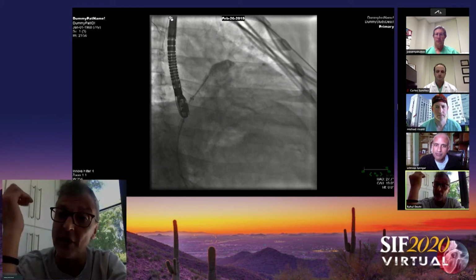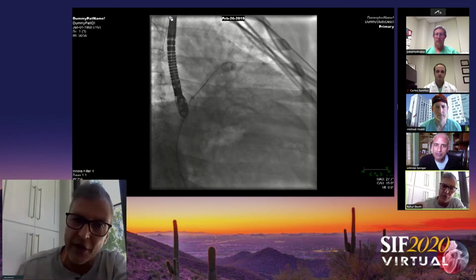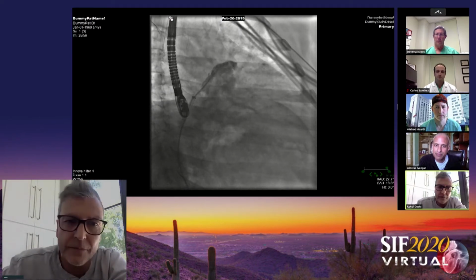And that's certainly something we see all the time in the EP world with catheter ablation around the orifice of the appendage.